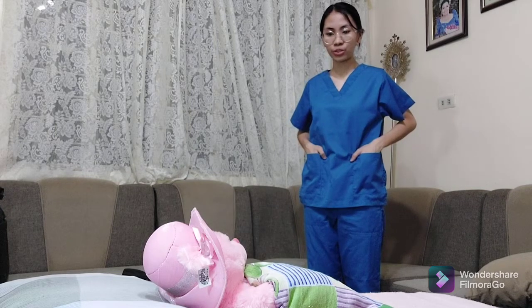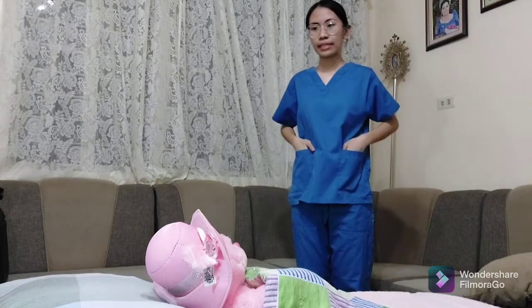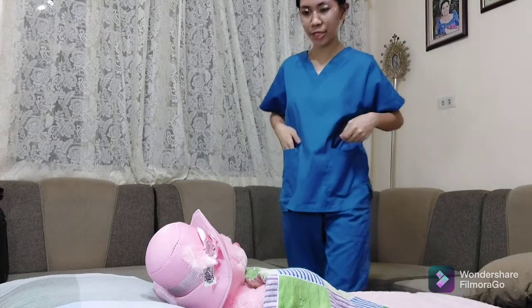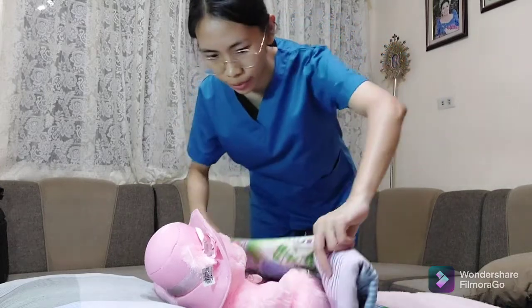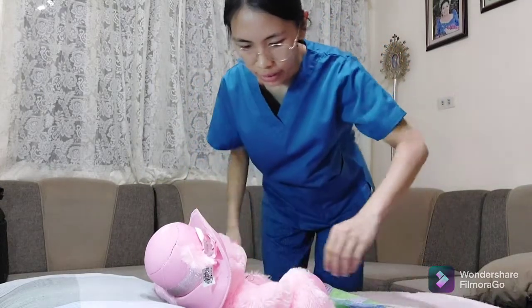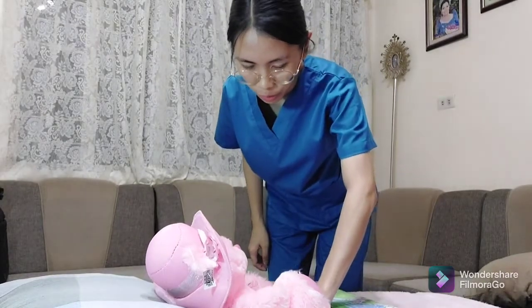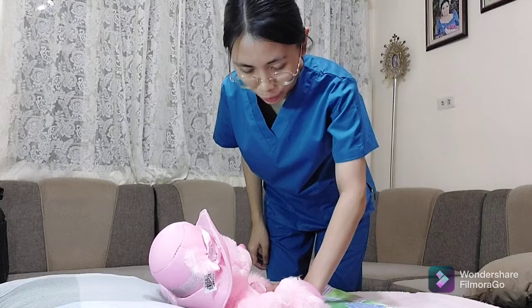Before we begin, I am going to close the door so that we can have your privacy. Then I'm going to assess the bladder fullness and pain by palpation or by using a bladder scanner. The rationale is that palpation of a full bladder will cause an urge to void and pain.